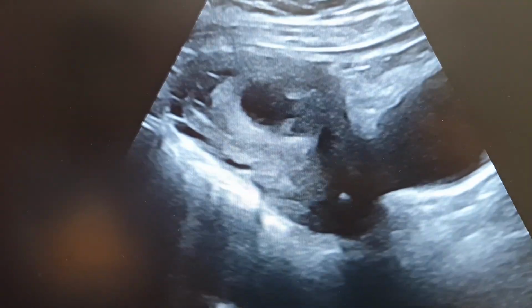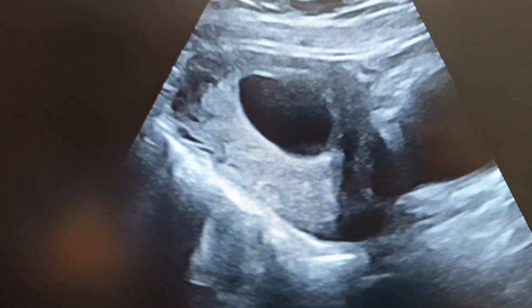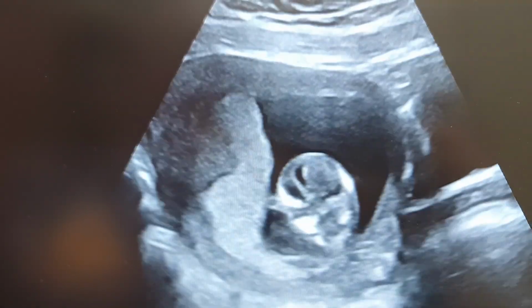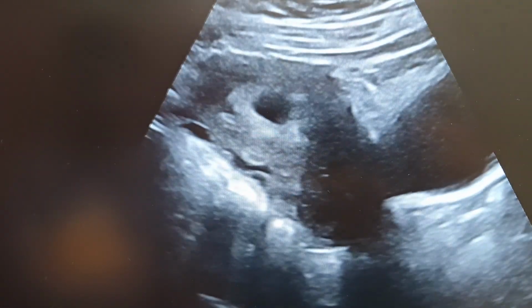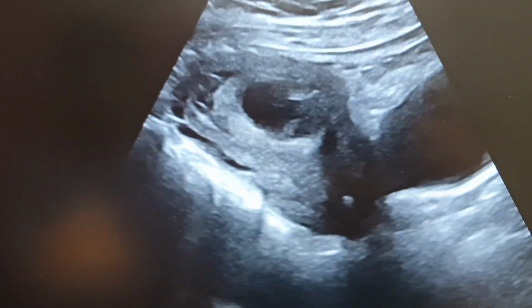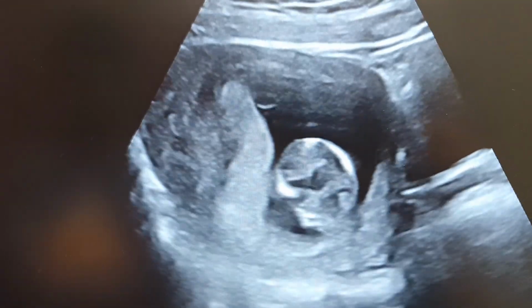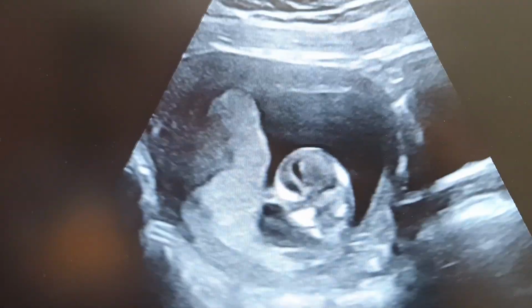The first step would be to locate the placenta. This is important because if the placenta is located on one of the lateral walls, the opposite side uterine artery will be showing a high resistance flow. This is because of differential trophoblastic invasion that occurs predominantly on the placental side and less on the opposite side.